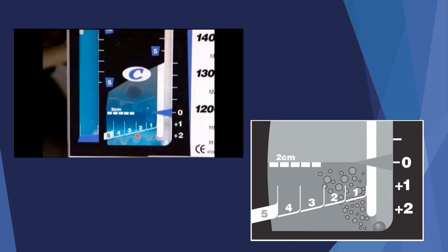You can see here there's no air leak because there are no bubbles. In here we have a small to, well, moderate leak. So we still have somewhat of a small air leak going on in here.